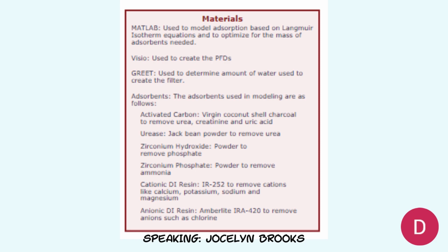We used a virgin coconut shell charcoal to remove urea, creatinine, and uric acid. This activated carbon is not in powdered form. As with powder, we wouldn't be able to maintain a high enough pressure in order for water to continuously run throughout the system. Next, we used urease. We used a jack bean powder urease to remove any excess urea that the activated carbon did not remove.